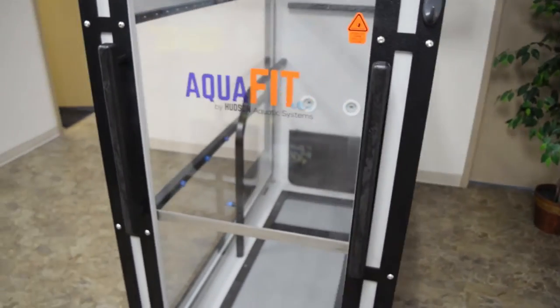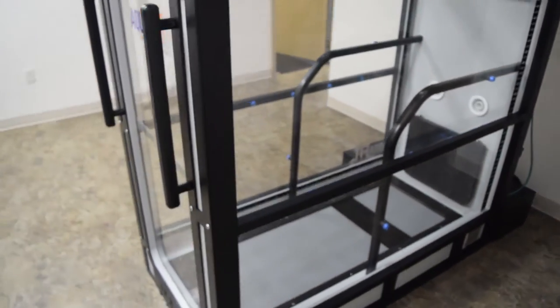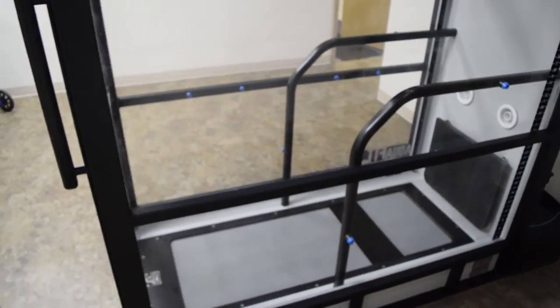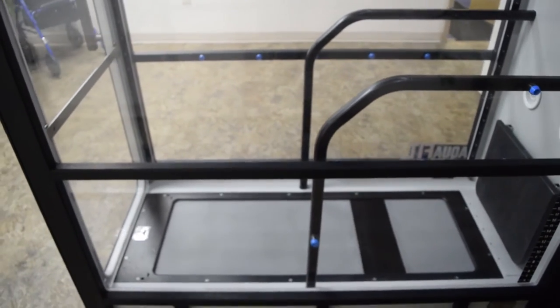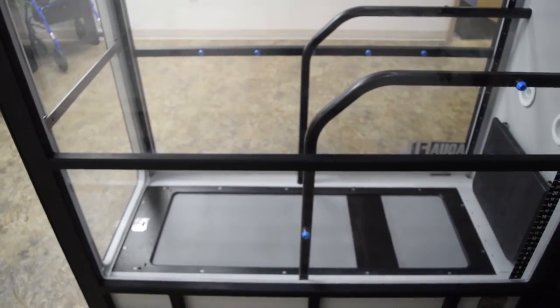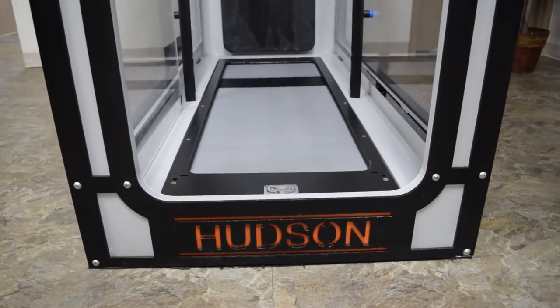With completely transparent viewing windows on three sides, the user's progress can be closely monitored. The low entry step is designed for easier entry for patients with limited mobility.